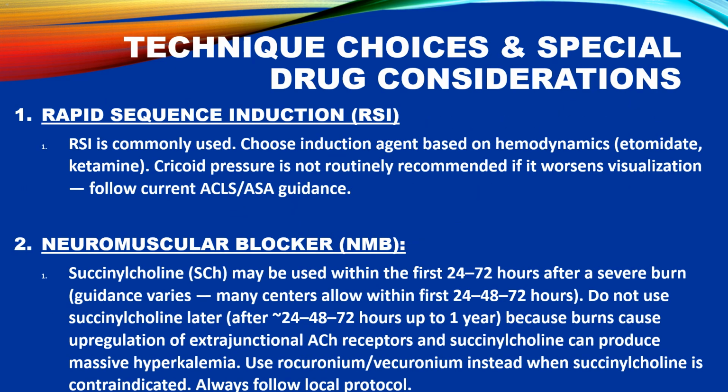Technique choices and special drug considerations for intubation. 1. Rapid sequence induction, RSI. Commonly used technique. RSI is commonly used for intubation in burn patients. Induction agent choice. Choose induction agent based on hemodynamics, such as etomidate or ketamine. 2. Neuromuscular blocker, NMB, choice.